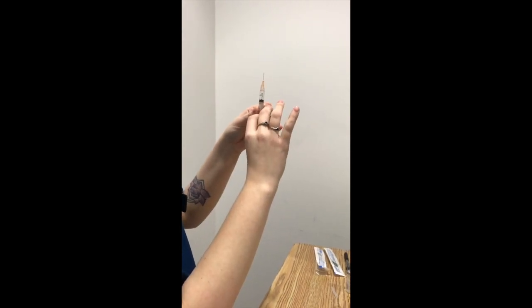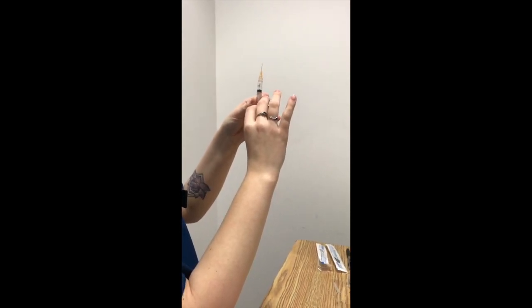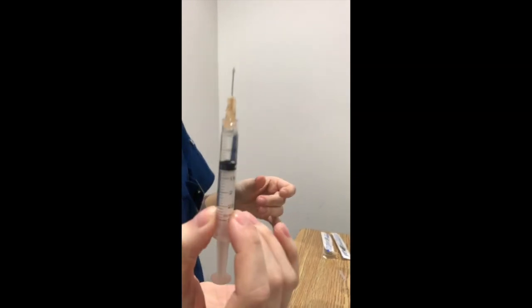And we're just going to flick out any air bubbles here. Get that to the top. And then as we can see here, we have 1 ml of fluid.